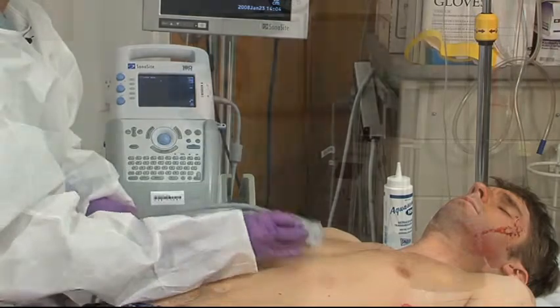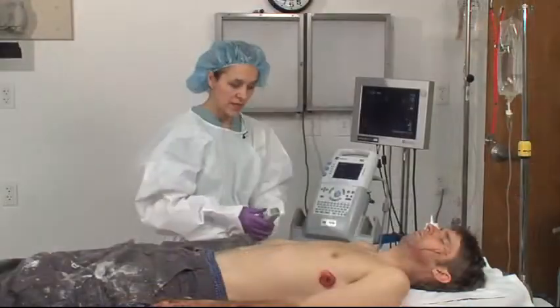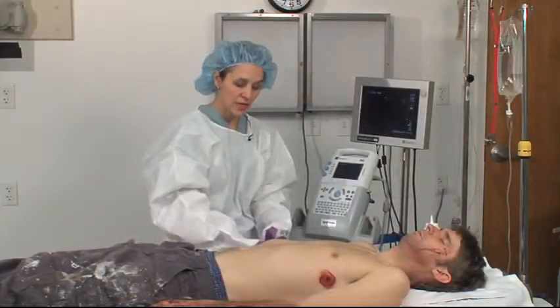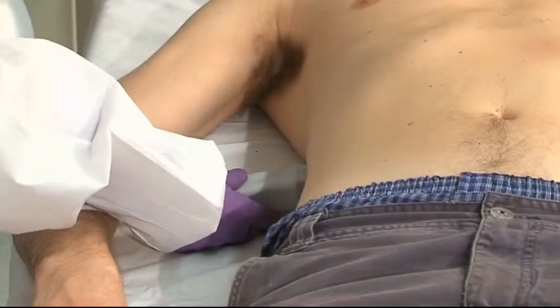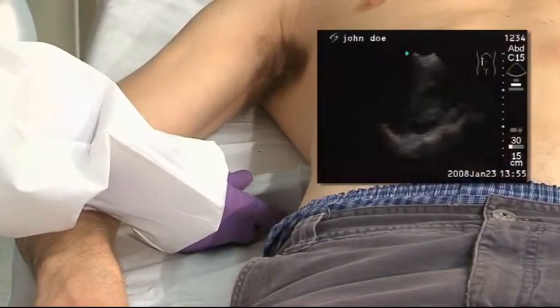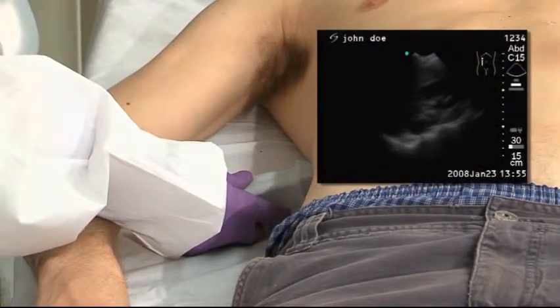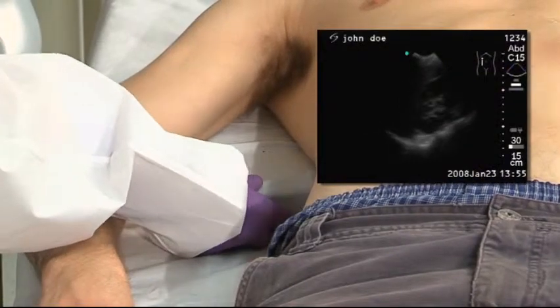The right upper quadrant is then imaged at the inferior aspect of the rib cage to find the liver and kidney interface.